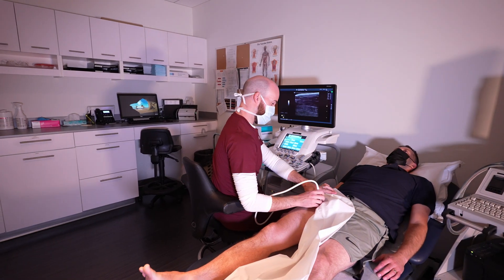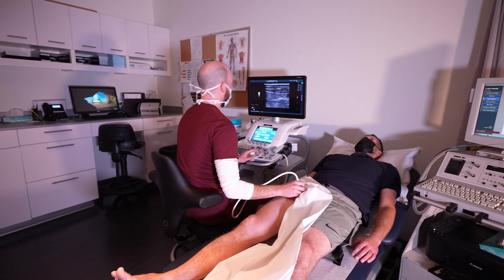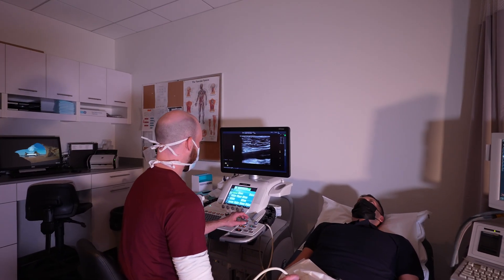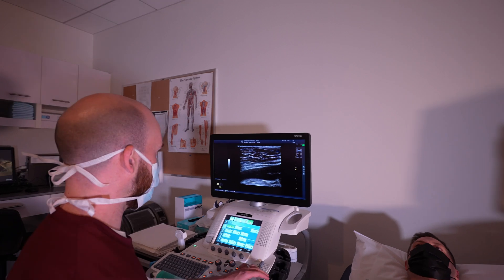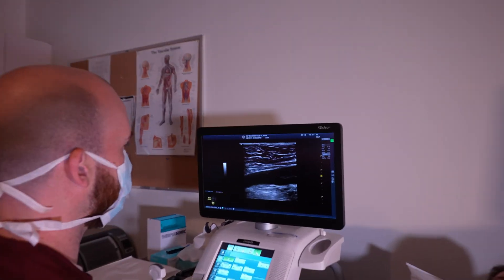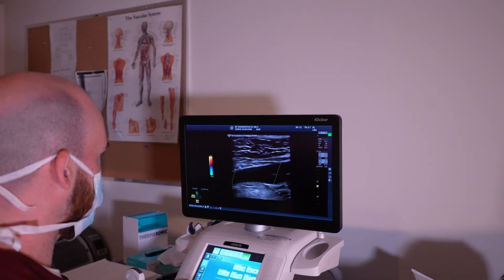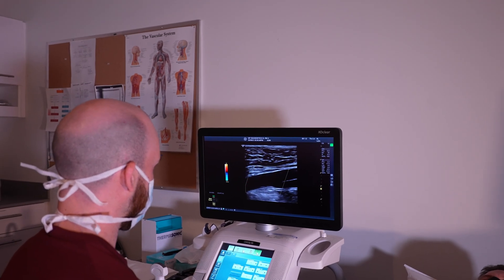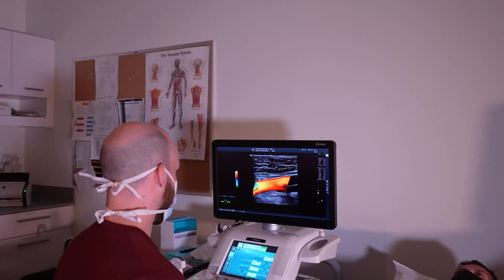For a leg arterial ultrasound scan, we start at the groin for each patient and then we follow the leg down to the ankle. We apply some jelly and take pictures at multiple levels to ensure we're imaging all of the blood vessels as needed and making the most appropriate diagnosis.